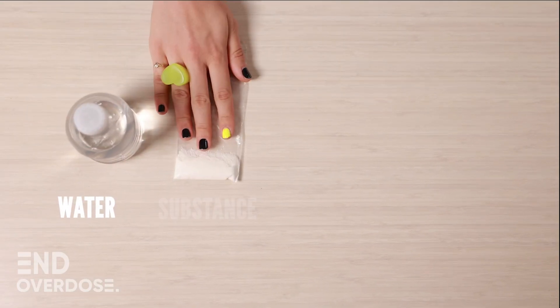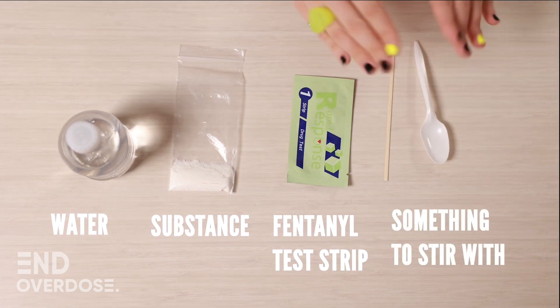Here's what you're going to need: water, your substance, a fentanyl test strip, and something you can stir with.